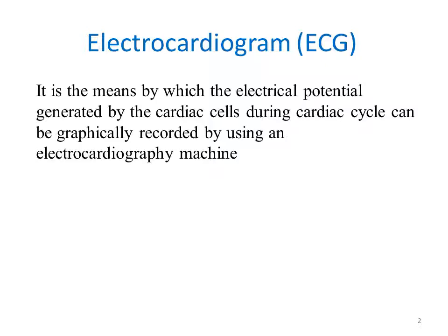Electrocardiogram, it's the means by which the electrical potential generated by the cardiac cells during the cardiac cycle can be graphically recorded by using an electrocardiography machine. يعني هو تسجيل النشاط الكهربائي لعضلة القلب.